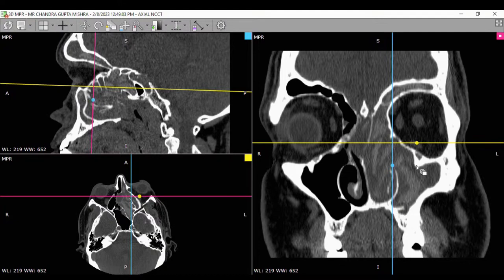Yes, sir. So this was all about allergic fungal rhinosinusitis, the kind of pathology it is. It requires an extensive approach to remove all fungal and mucin material and give wide openings, and a hydrodebrider to rinse any fungal particles left over the mucosa, like that. And that is how we could clear this.